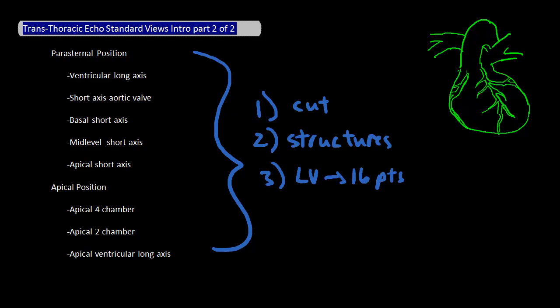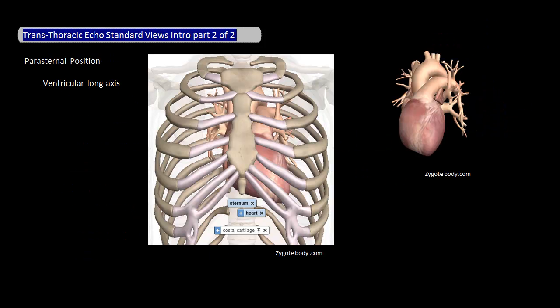The first view is the parasternal ventricular long axis view, which is at the parasternal position. Picture that you're looking at the heart from the lateral side, and the cut across the heart that you're trying to make with this view is across the left ventricle and aortic valve.